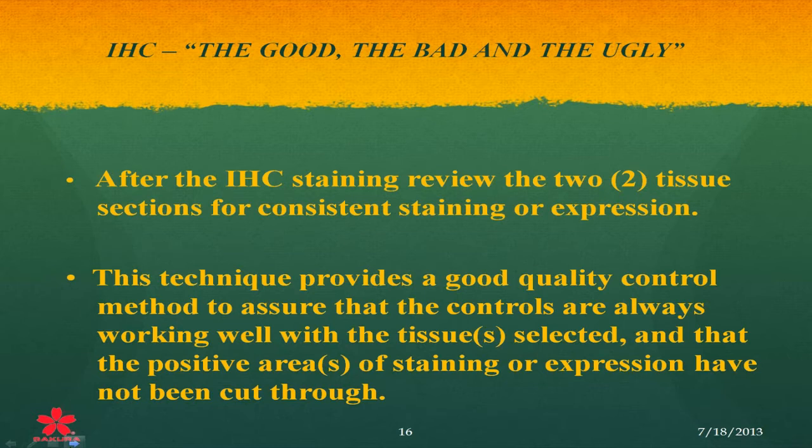You don't want to pick up a control slide and put that patient on that slide and then run it and it doesn't work. You're going to have to find another block and you're going to have to run that control again. It's going to be a repeat, and we're wanting to keep down our repeats.